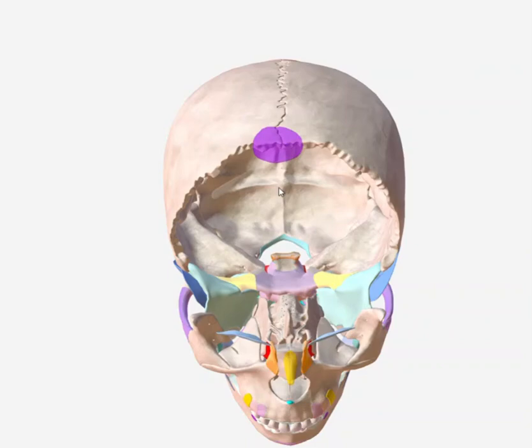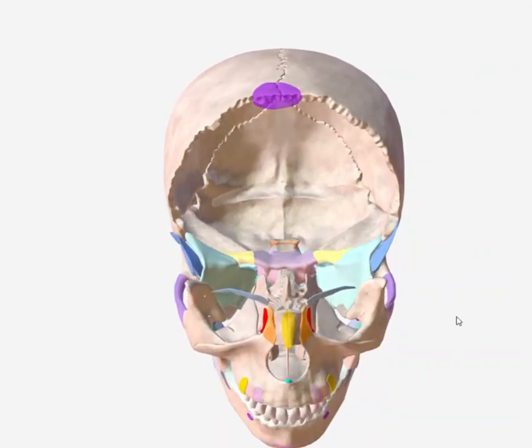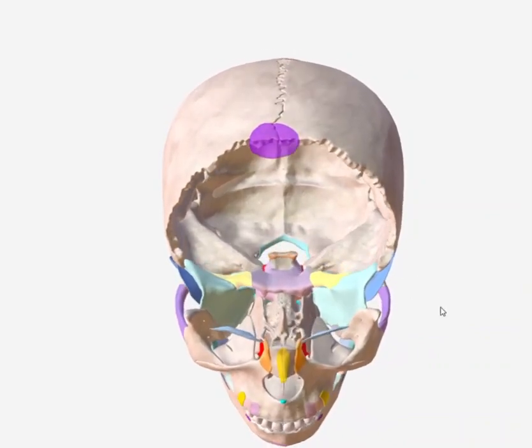So that means if we have excessive angulation of a Towne's position, that dorsum sella is going to keep getting projected lower and lower, more inferiorly than the foramen magnum. If we have insufficient angulation, it's going to do the same thing as an extension type of motion would do on our x-ray. So if we don't angle enough, that dorsum sella is not going to make it inferior enough to be inside the foramen magnum.